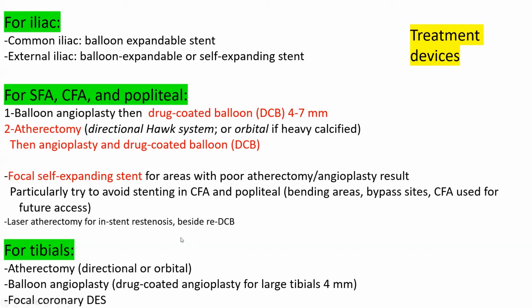Whereas it is proven to be useful for SFA in-stent restenosis. It is useful for neointimal hyperplasia. So if you have in-stent restenosis, I would use laser atherectomy and drug-coated balloon. For tibial vessels, we also typically use atherectomy.